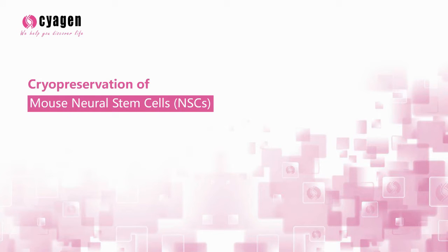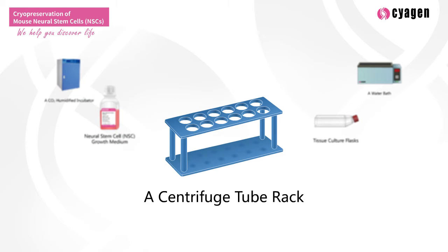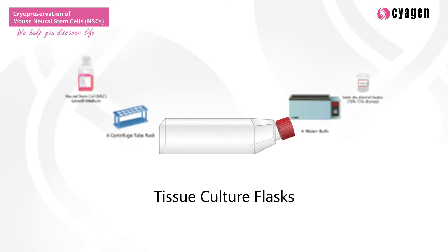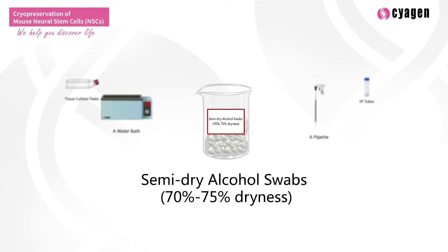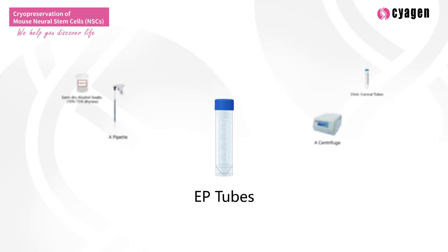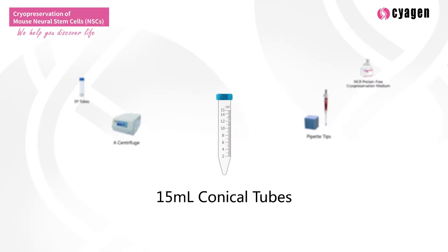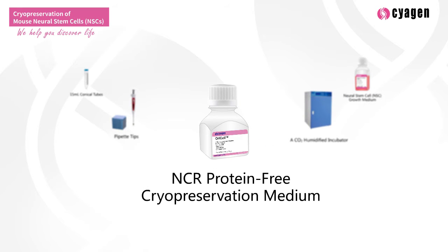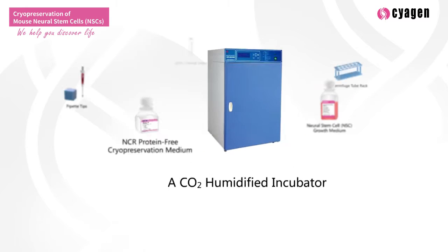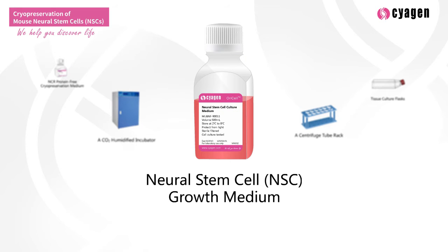Cryopreservation of mouse neural stem cells. Materials required: a centrifuge tube rack, tissue culture flask, a water bath, semi-dry alcohol swabs, a pipette, EP tubes, a centrifuge, 15 ml conical tubes, pipette tips, NCR protein-free cryopreservation medium, a CO2 humidified incubator, neural stem cell growth medium.